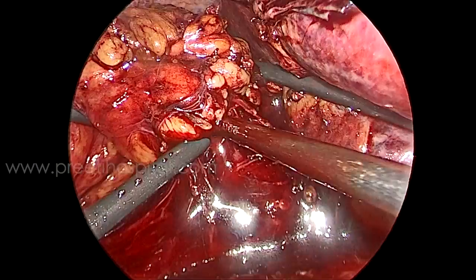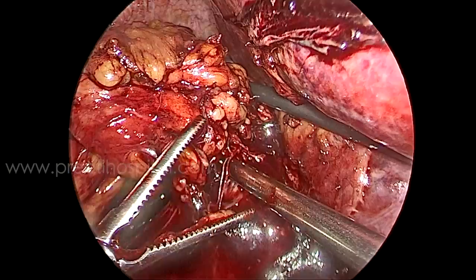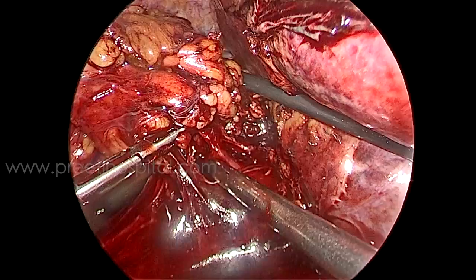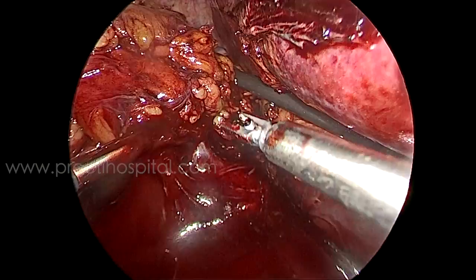Pressing with the non-traumatic forceps is the key in controlling the bleeding and avoiding morbidity and mortality. That instrument has to press, and slowly on the lateral border, traction with suction is helping. Then I hold it and I can see — now I am ready with the clip. It's a small opening, no need to worry. I've taken the metal clip fast and applied it on this side.